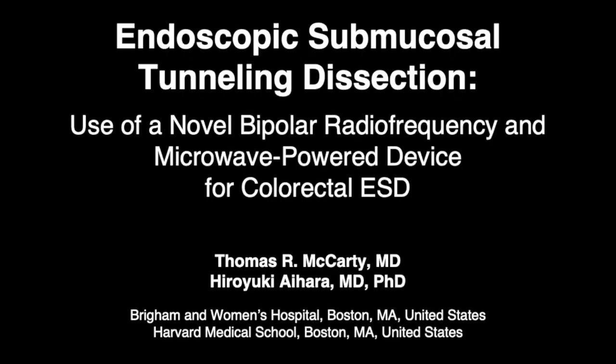In this video GIE submission, we demonstrate use of an endoscopic submucosal tunneling dissection technique using a novel bipolar radiofrequency and microwave-powered device to perform rectal ESD.